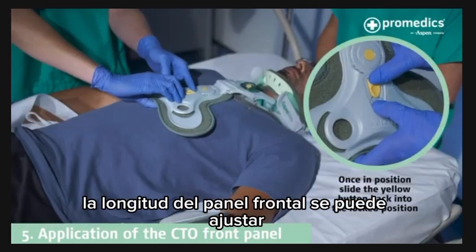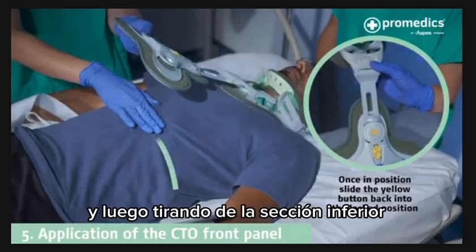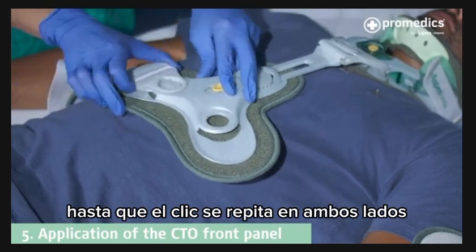The length of the front panel can be adjusted by pulling the yellow button down and then pulling on the lower section and positioning on the lower rib. Take the clip and place it back into position until it clicks. Repeat on both sides.